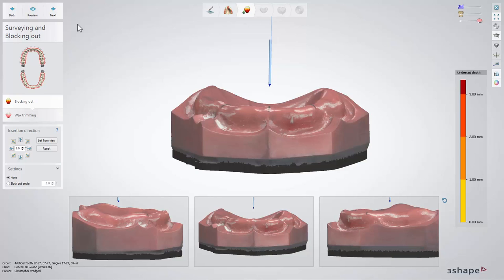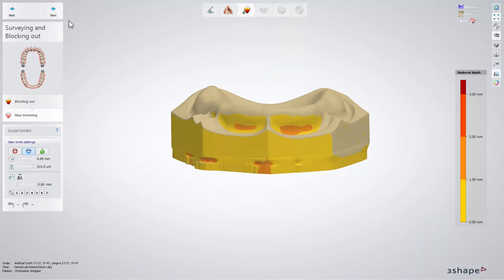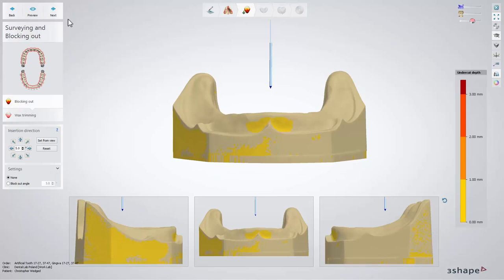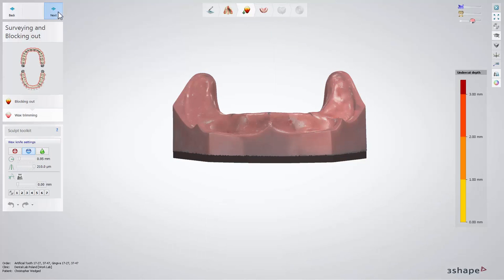Moving on to the surveying and blocking out step. The software will calculate the proposition for the insertion direction, showing also the undercuts on the model. If you are going to make a try-in denture, you might need to block any undercuts with the help of wax for the upper jaw, and next the lower jaw. You can skip this option if this is something that you don't need.